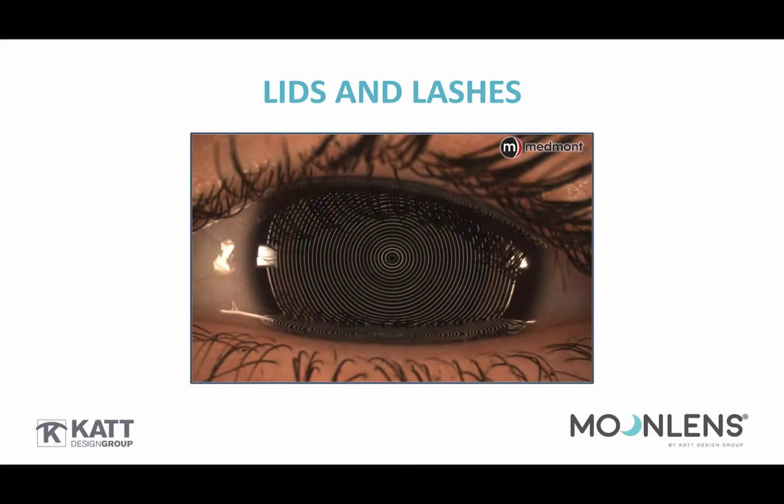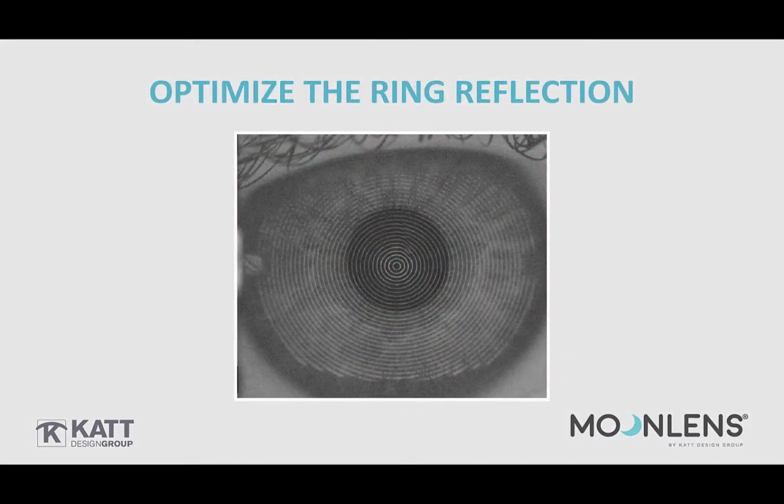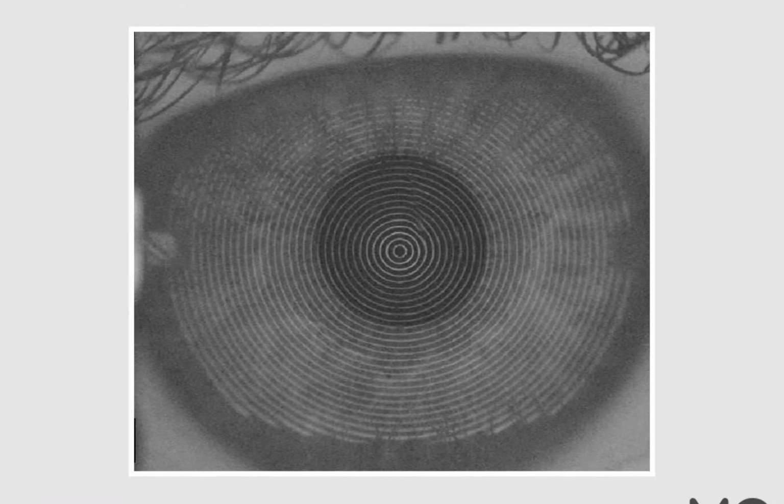When capturing topographies, have the patient open up as wide as possible. Minimize lid interference, eyelash shadows, and tear wedges on the lower lid that can hinder the coverage and quality of imaging. Ensure that the rings reflect in a smooth, even, and parallel manner. Tear breakup will present as distortion of the rings and can ruin the quality and accuracy of your map.